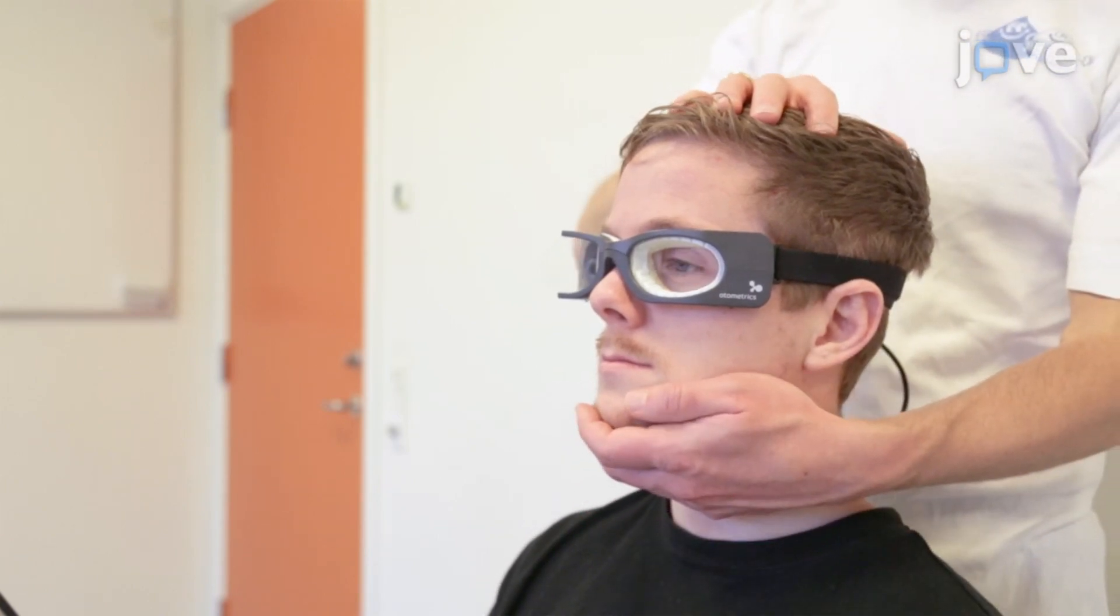To perform vertical SCC testing, place the dominant hand on top of the participant's head, and direct the fingers in the direction of the anterior SCC to be tested. Place the non-dominant hand on the chin.